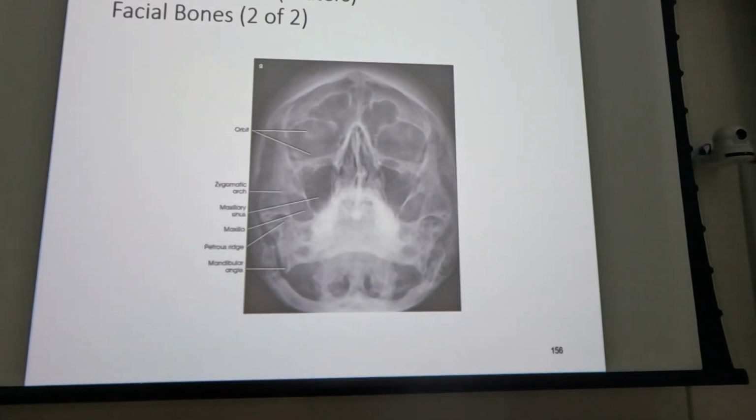Okay, so if they've got a broken nasal septum, vomer, do you think that you could diagnose that? Probably so. So again, if they get hit in the eye and one of these fills up with fluid, we can diagnose, maybe not, we might not be able to visualize the fracture, but we can see evidence of the fracture. Kind of like fat pads that we talked about in upper extremity last semester, lower extremity last semester. Evidence that there is a fracture would be present in that full maxillary sinus.